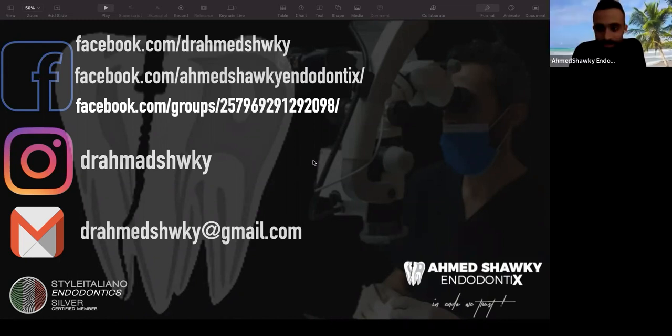Do I need to use the bioceramic sealer if I'm using carrier based gutta percha? It's not about whether you need to or not. It's about your technique. Nowadays, we have bioceramic sealers that are heat friendly. So we have done a lot of cases with the gutta core, for example, and the heat friendly sealer.